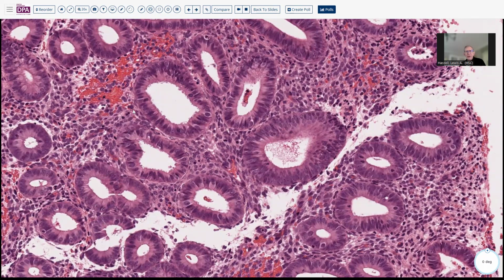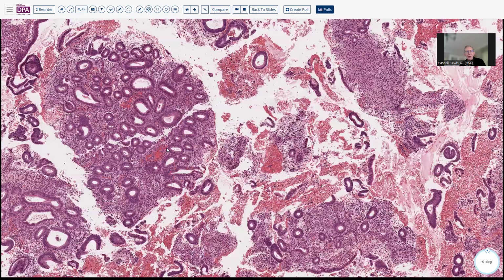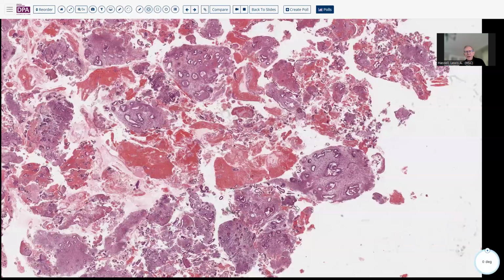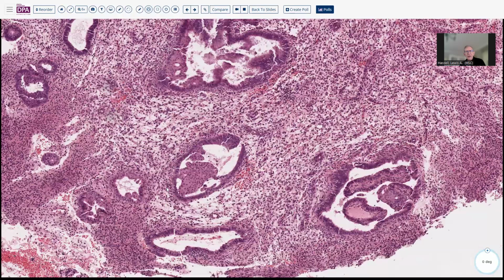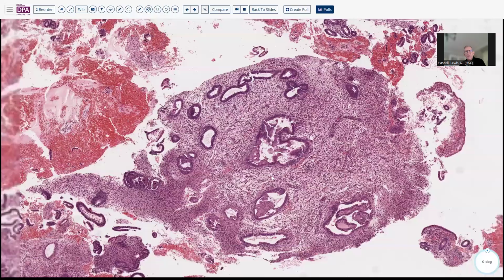Still, you'll find mitotic figures in this situation and a size here of greater than a millimeter in that location. So not a florid example, not a case where you're going to be highly concerned about the boundary between this and neoplasia, but one where you can definitely discern a difference, see the architectural changes. Here's a little bit of metaplasia going on as well. Now notice here we have an area where the gland-to-stroma ratio is not significantly altered, but where we have other areas where we've identified that, we would still include this as a portion of that change.